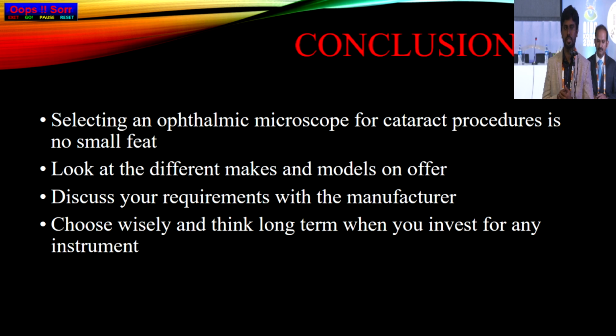Otherwise, AMC, CMC for a microscope, I don't think it is needed. Definitely the microscope will last for ages. It doesn't go off at all. I don't know about the life of the LED, but with the previous bulbs, it fuses, you change it, that's it. So AMC, CMC is not needed.